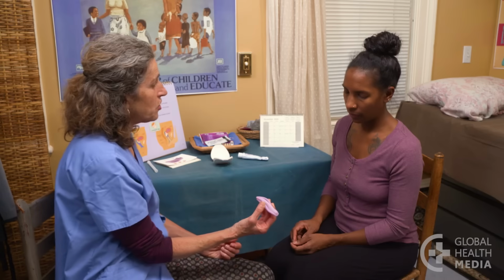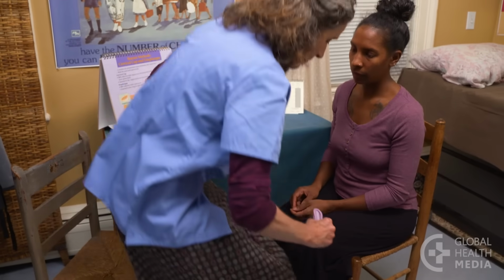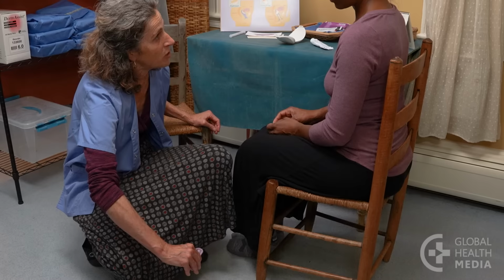Choose a comfortable position, such as lying down, standing with one leg up, or squatting.